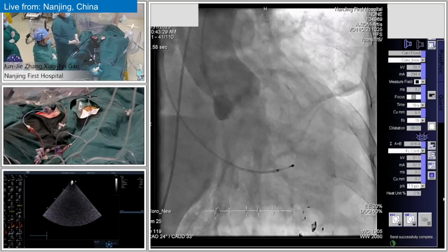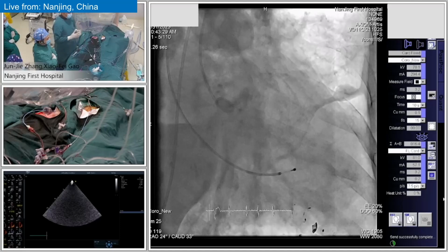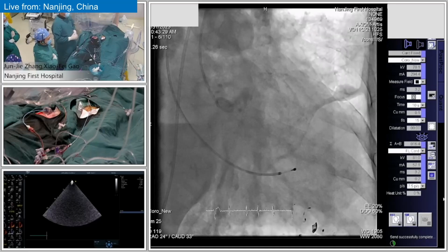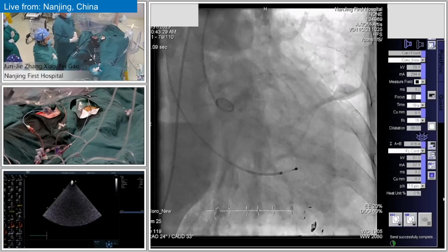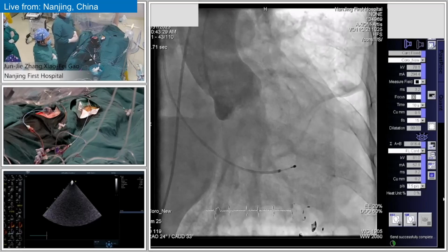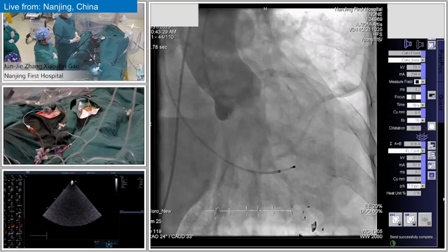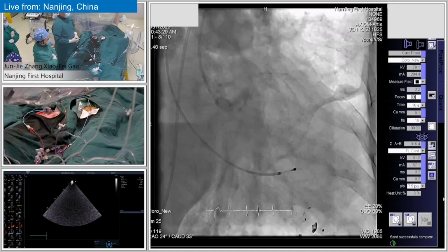I think the most important is the aortic annulus dimension. If you have a small annulus, something like less than 28, or a low height of the coronary, right or left main height less than 10 millimeters, or maybe the leaflet is higher than the coronary origin, there will be an increased risk of coronary obstruction during the TAVI procedure. I think this is important in our CT analysis.